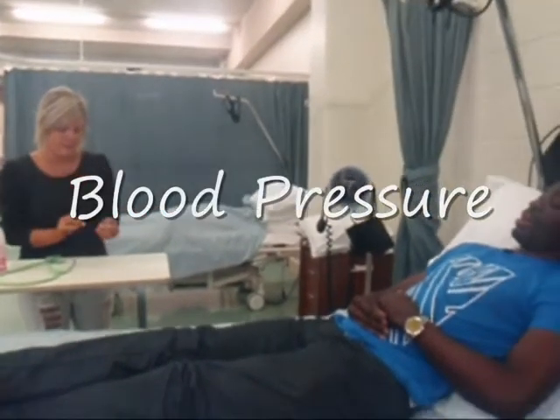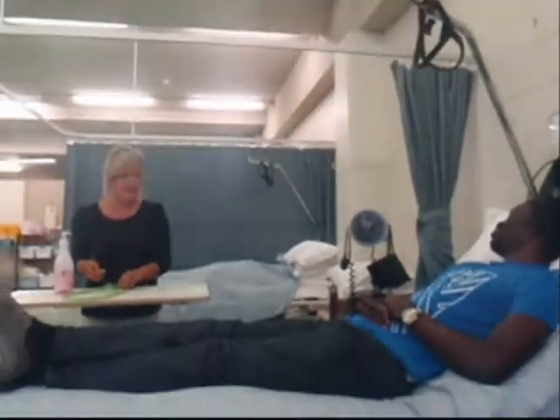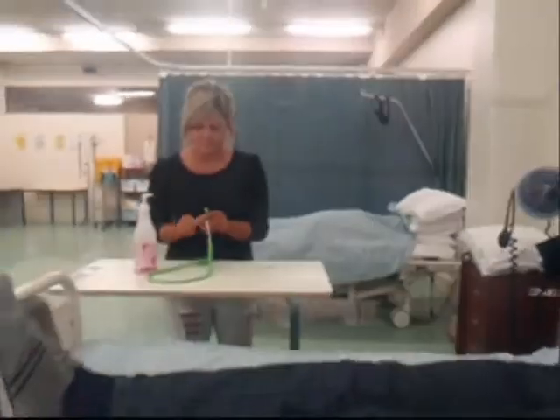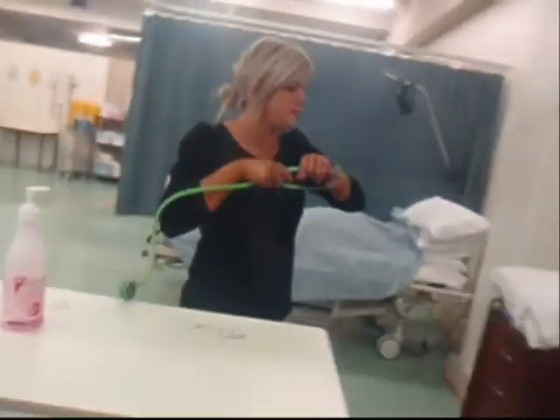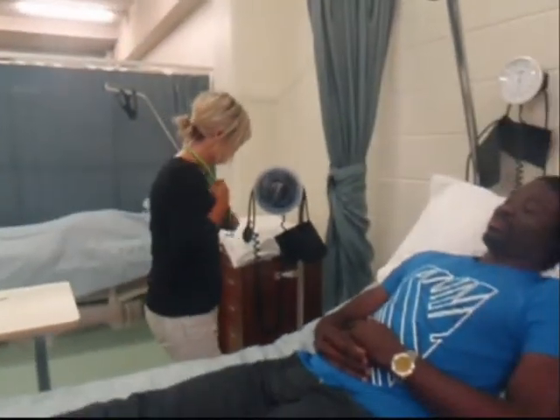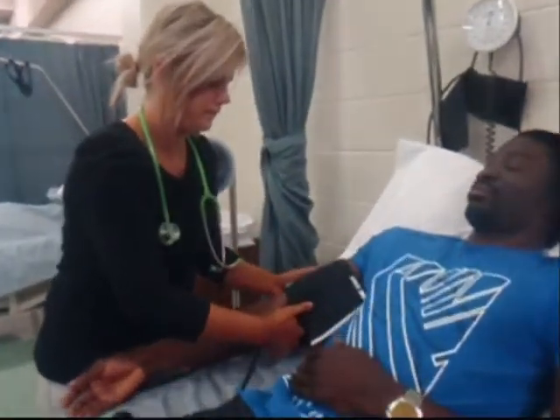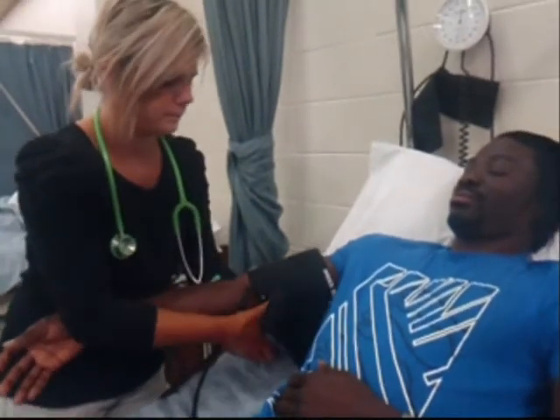Blood pressure is the force on the wall of the artery by the pulsing blood under pressure from the heart. Blood pressure is most accurately recorded using a mercury sphygmomanometer. To take blood pressure, the patient should be comfortably sitting or lying down. The cuff of the sphygmomanometer is placed on the upper arm, centred above the brachial artery.